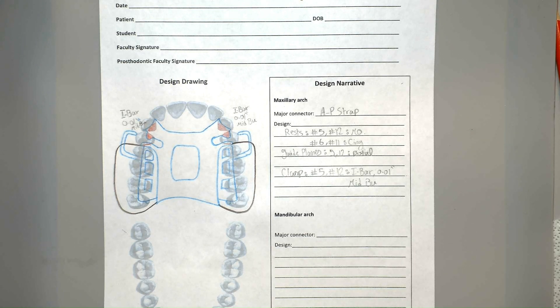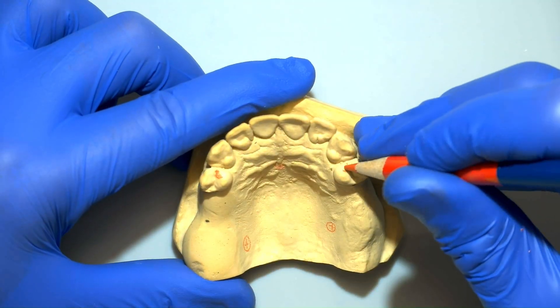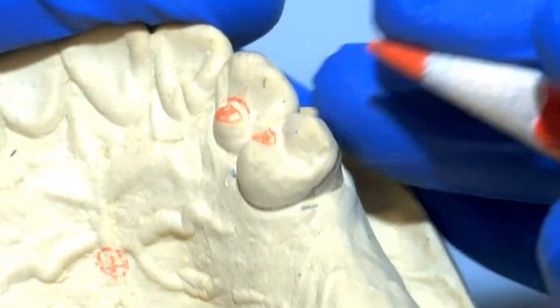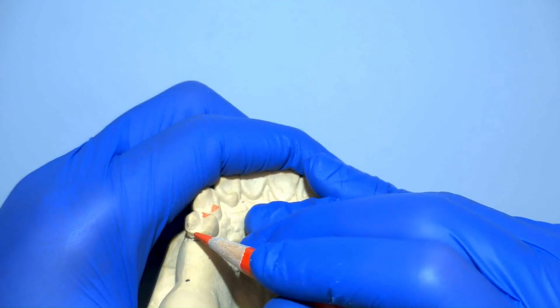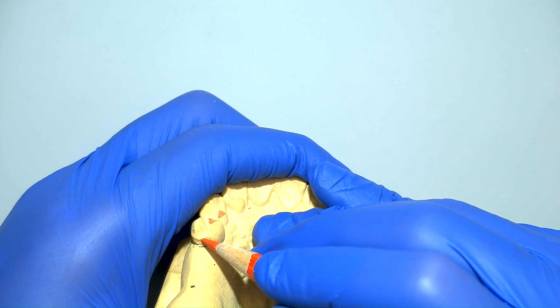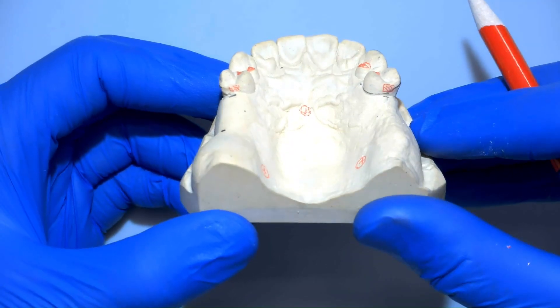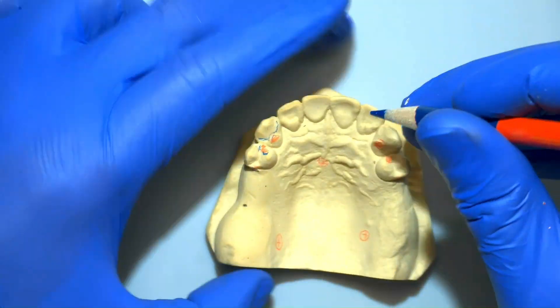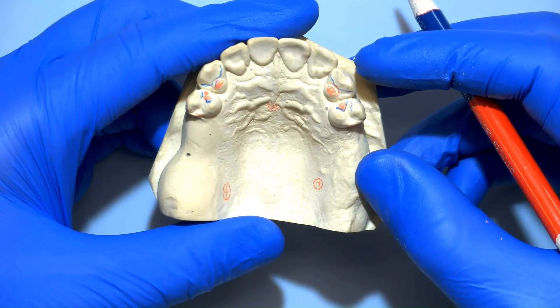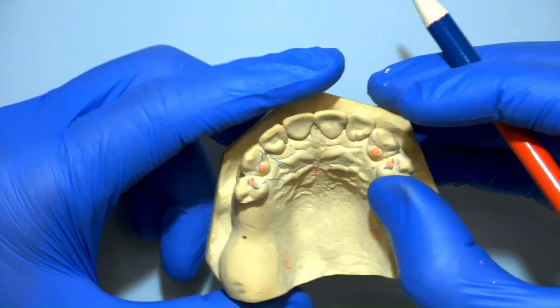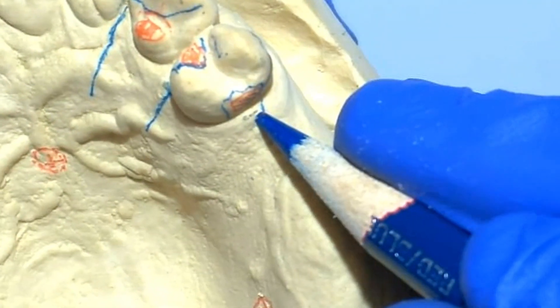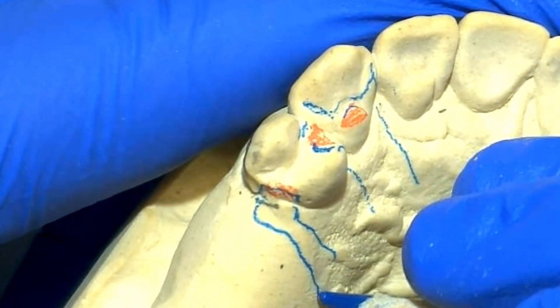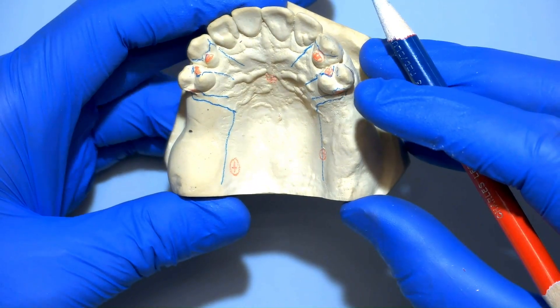With that we can now transition to drawing the same design but on the cast. We will start by drawing our rest seats in red. The next thing to do is to draw the areas of the guide planes. Red denotes areas included in the mouth preparation, including guide planes and undercuts that are going to be added or adjusted in the patient's mouth. Next we're going to start drawing the framework in blue, following the same steps we did on the paper drawing: first outlining each rest seat, then dropping minor connectors down from each edge of each rest seat. Then we'll outline the guide plane and extend the last minor connector next to the edentulous space all the way back as the finish line.